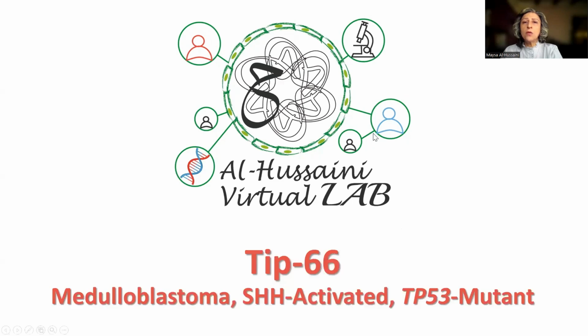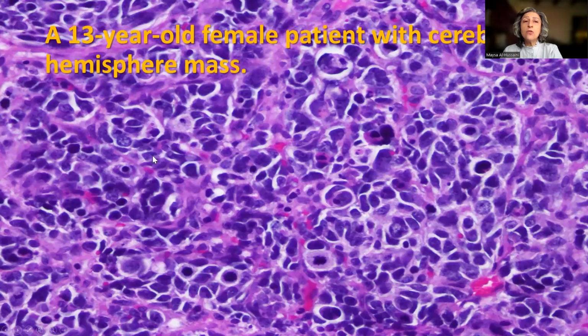What I'm going to be sharing with you today is a case of medulloblastoma, SHH-activated TP53-mutant, and how we can reach this diagnosis utilizing only immunohistochemistry. So this is a case of a 13-year-old female patient with cerebellar hemispheric mass, and as you can see, this is a small round blue cell tumor. It's an embryonal tumor, but showing severe diffuse anaplasia.